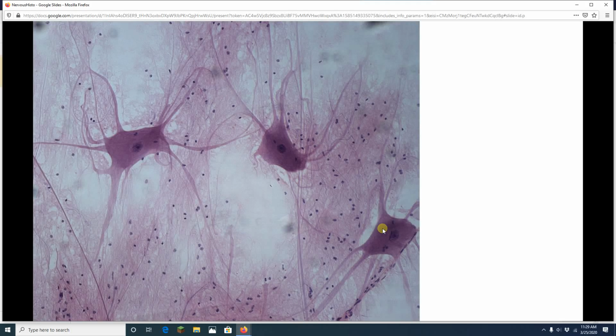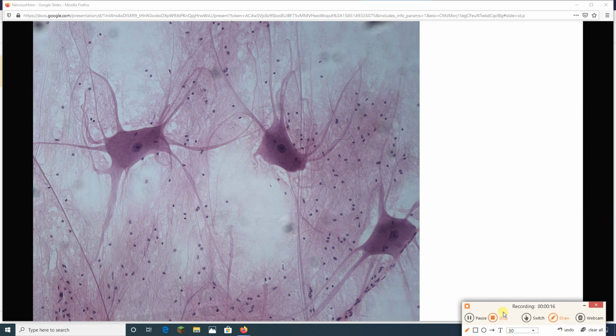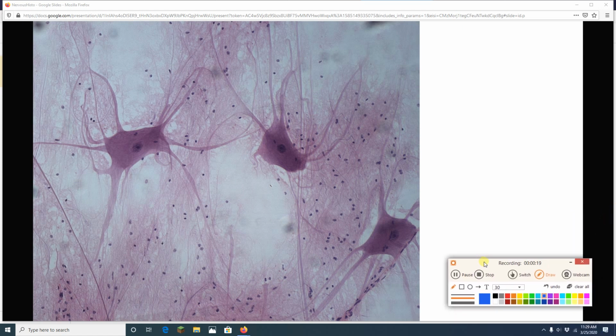Welcome to my quick little video about nervous system histology. Alright, what we are looking at right here is the ventral horn of the spinal cord. Ventral horn of the spinal cord. So remember your gross anatomy of the spinal cord that you did? I hope you remember that.